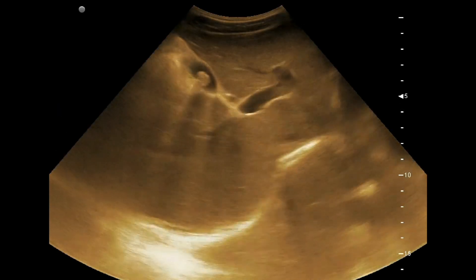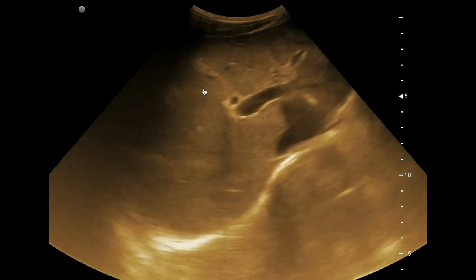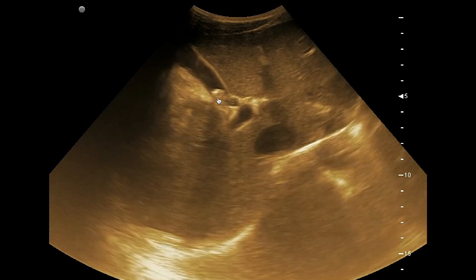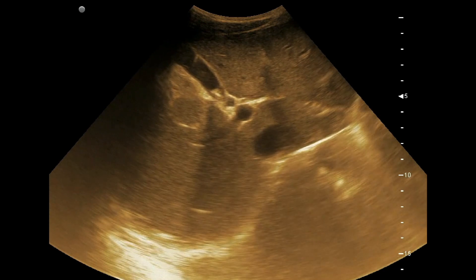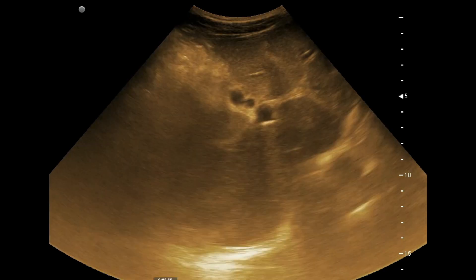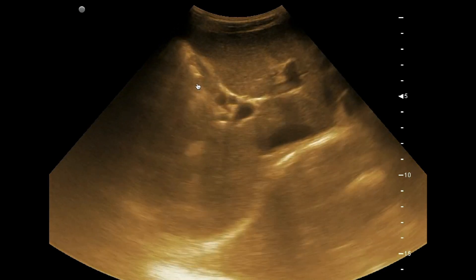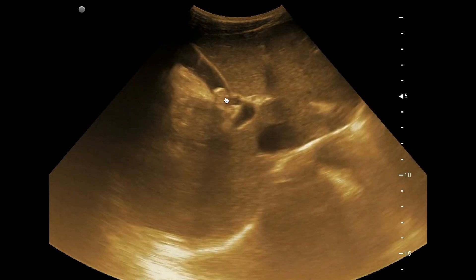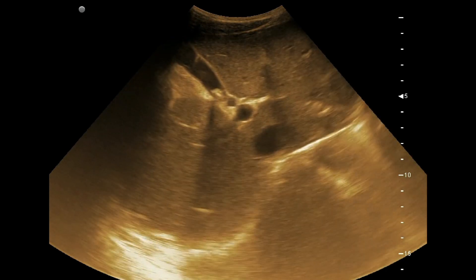Here you can see the right lobe of the liver. You can see the gallbladder lumen shows a bright hyperechogenic structure casting acoustic shadow, and this structure is moving with the change of posture. The patient was in sitting position and we have turned the patient to supine, and you can see the movement.